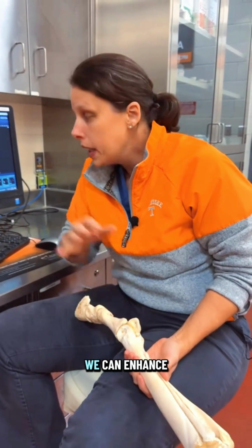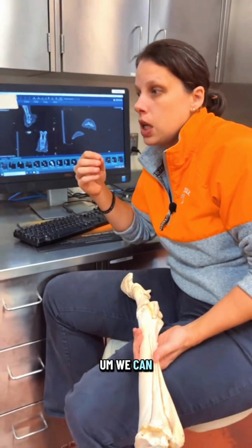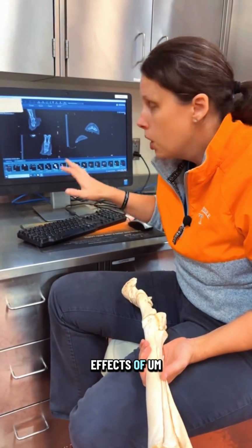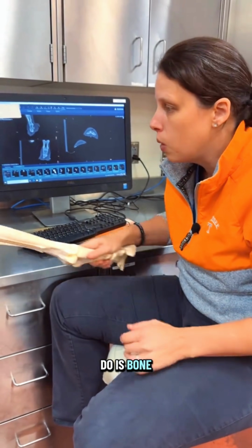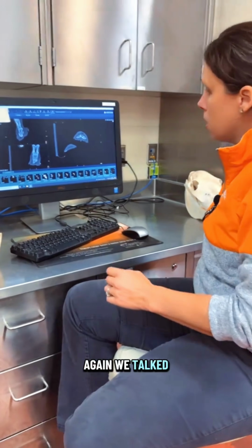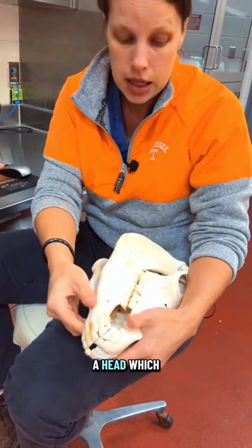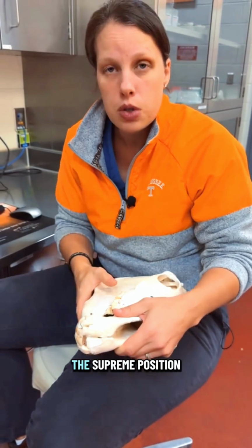So we can enhance with contrast. You can see soft tissue things. We can enhance tumors. We can do a lot of things with kind of manipulating the effects of what the CT can do, but the main thing that its job is to do is bone. And its primary use, again, we talked last time about all the superimposition. Think of how easy it would be to do a CT of something like a head, which again, we're getting these really tiny slices. It stops all the superimposition.